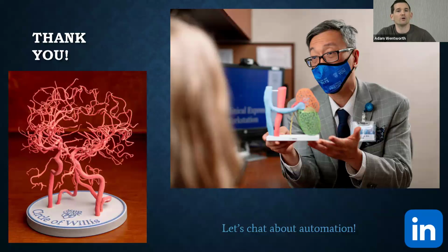You're not going to script everything, but you're going to script the things that you are clicking the same buttons for this type of model that you do regularly. I will say that there's a bit of intelligence also baked into that. So you can build QA into the script as well to perform some of these checks along the way. For example, the fiducials that I marked on that model, we'll do calculations within the script to check it's within a certain range of acceptable values, or we do that during development.